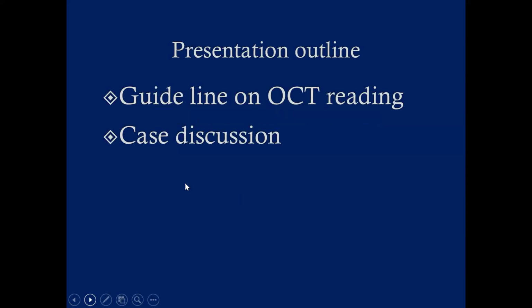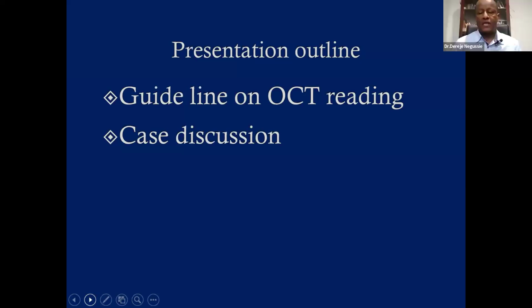Okay. In our presentation today, this is my outline. I will discuss the guideline of OCT, and then I will have some cases to discuss. In the meantime, while we are discussing, if someone wants to answer questions and the like, he can raise his hand on the chat box.